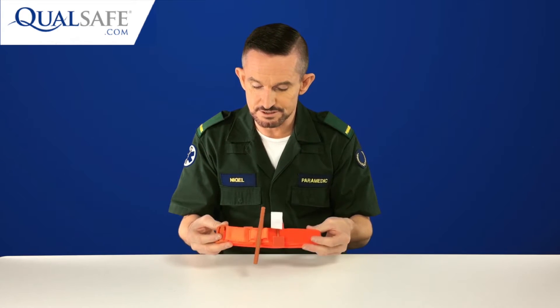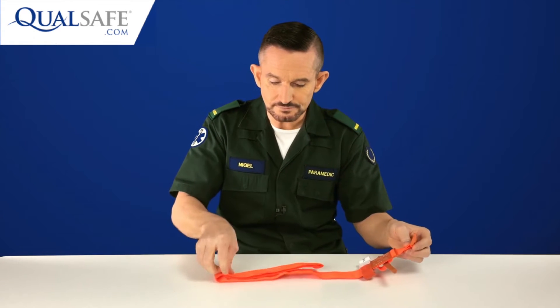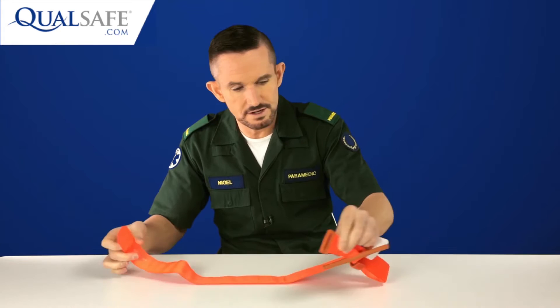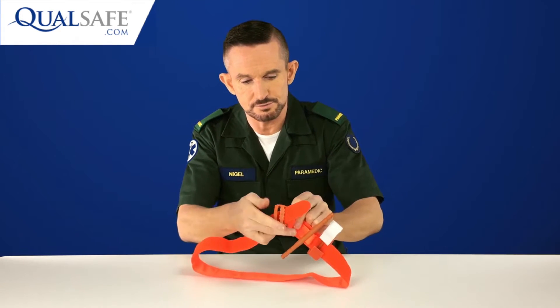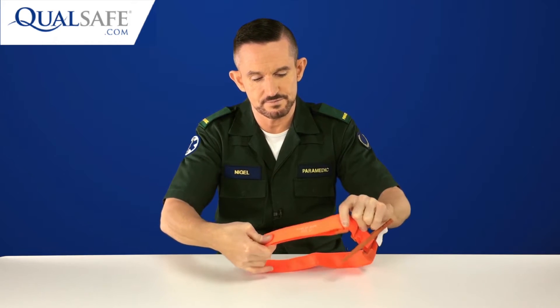The manufacturers of this tourniquet recommend that it is stored in your first aid kit ready for use. There's a belt buckle on one end — it literally just loops through like so, doubles back, and fastens down on the velcro.